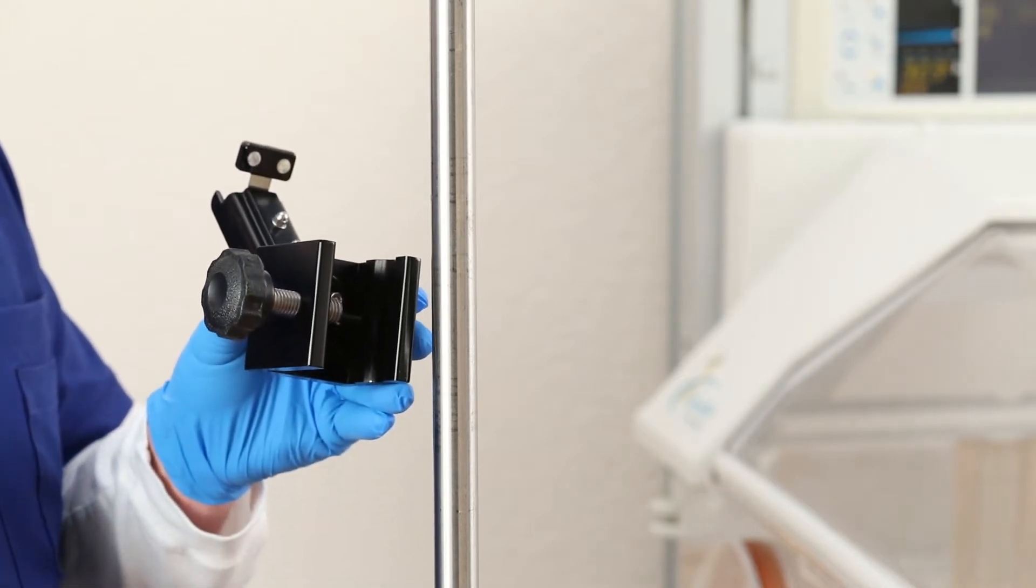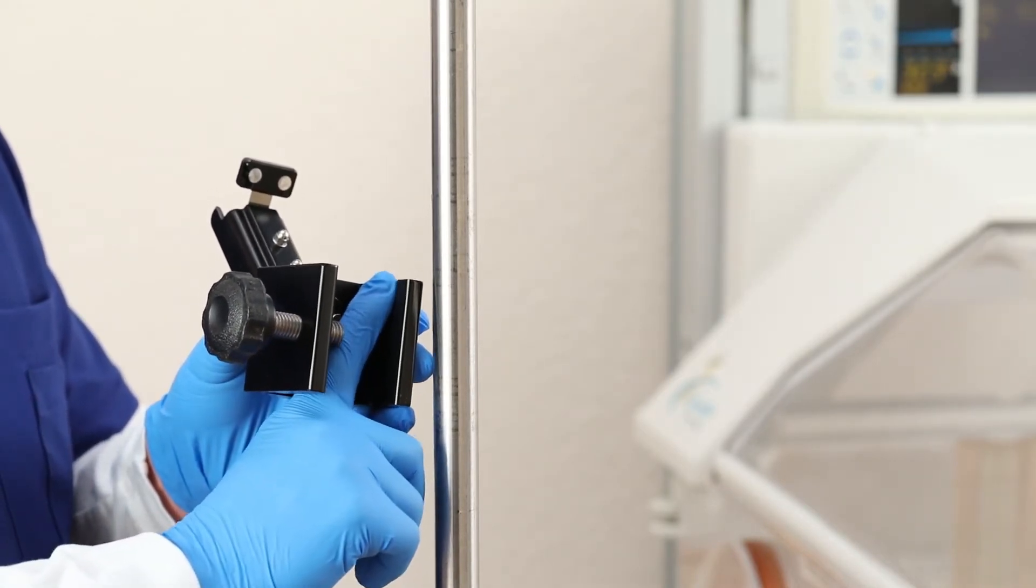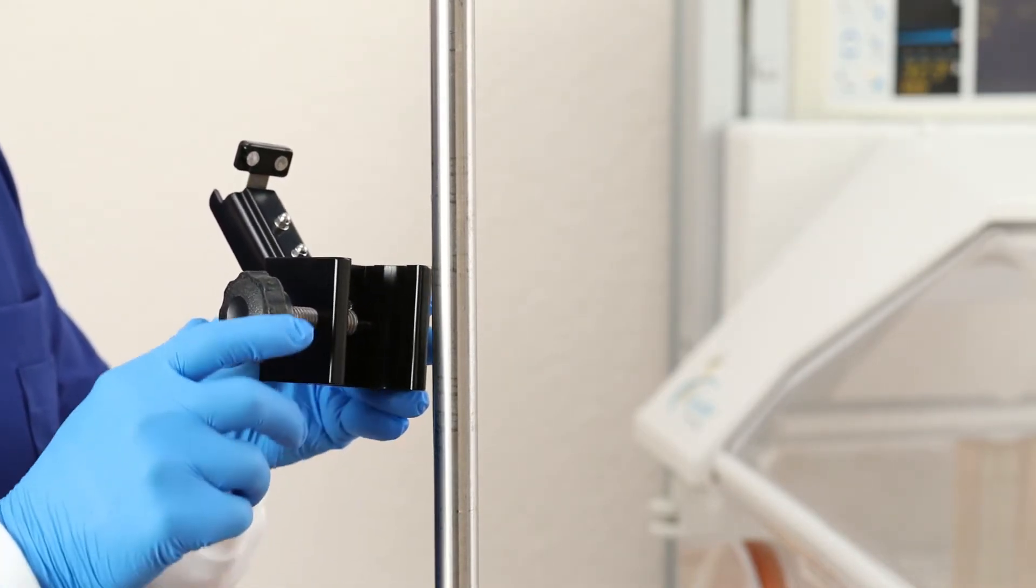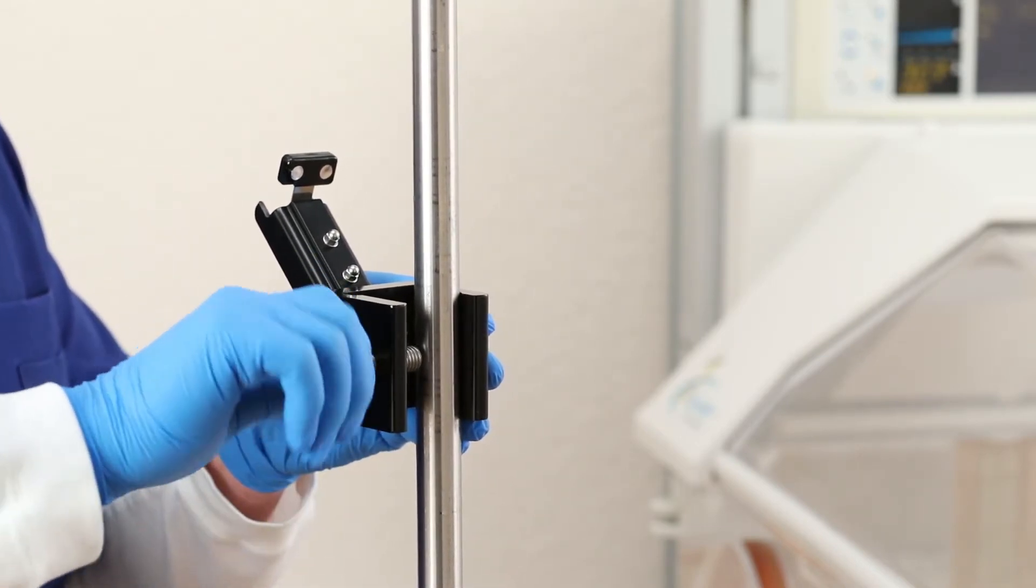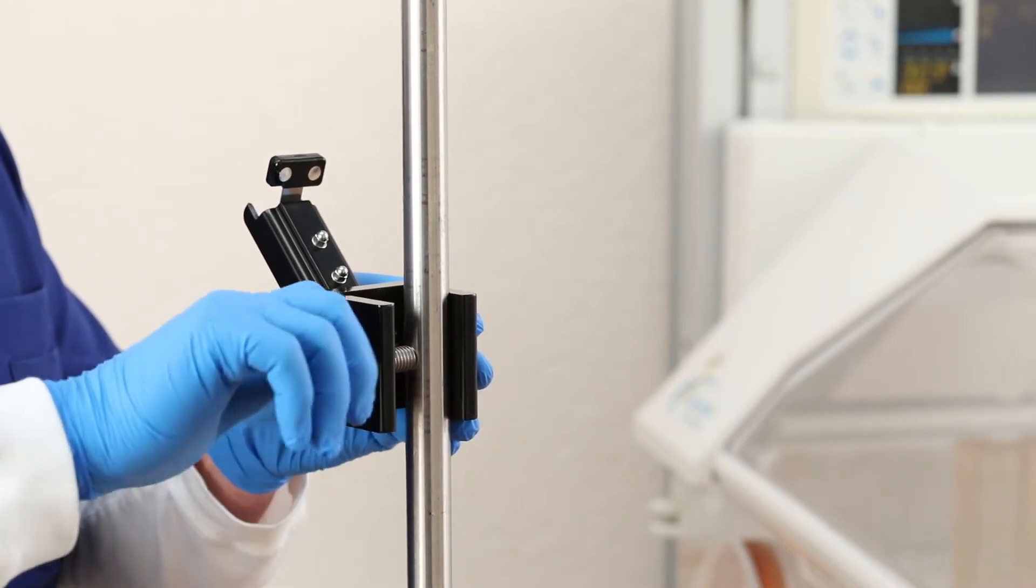The first step is to mount the clamp. Ensure the clamp is positioned so the curved channel is in alignment with the pole. The clamp can be easily mounted to a pole by tightening the screw knob clockwise to capture the clamp in the selected position for use.